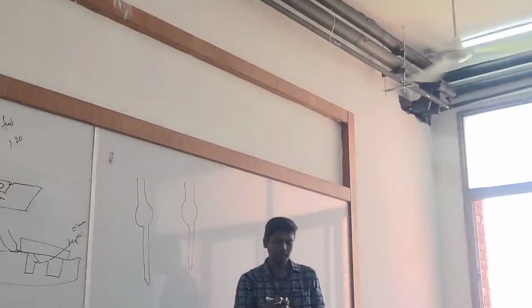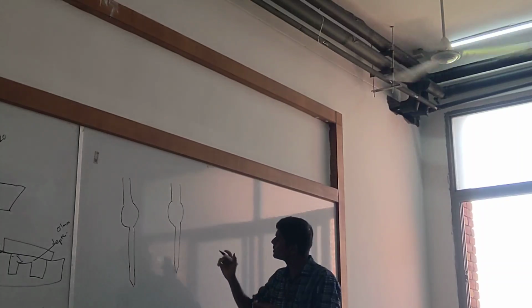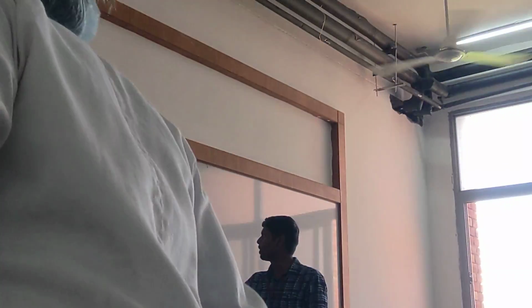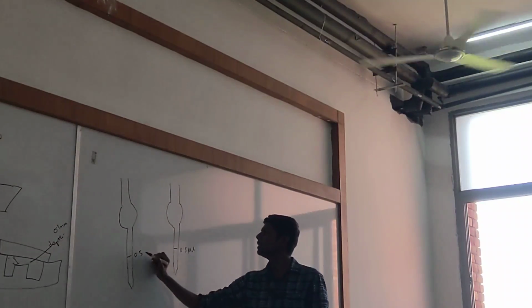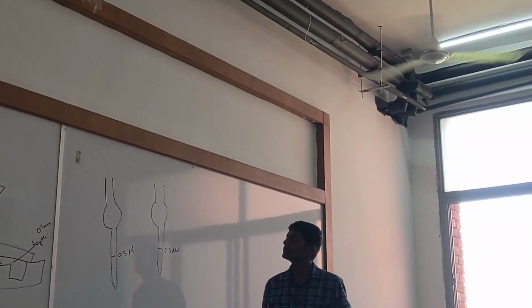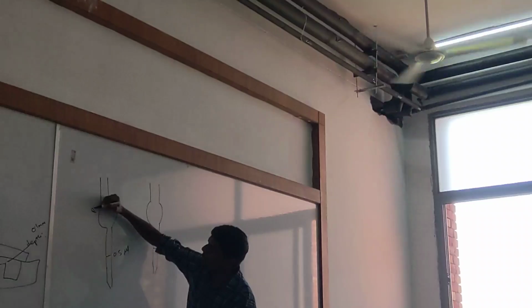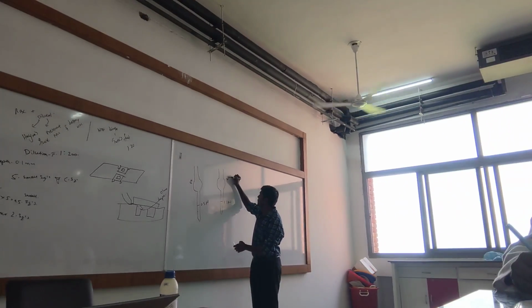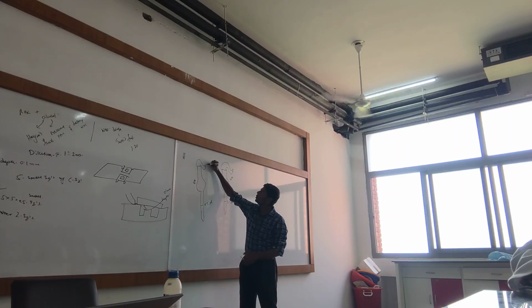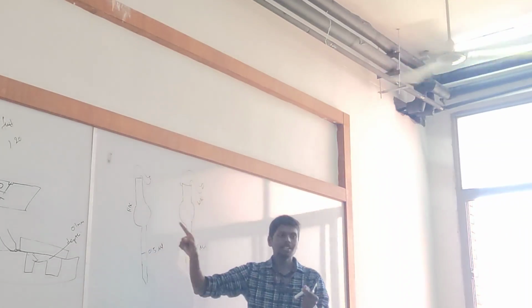Now, listen. The bottom is always 0.5 microliters. Okay. Now, this is the RBC pipette. This is the WBC pipette. This is the tube.